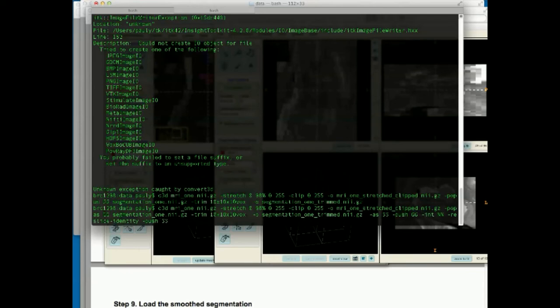Okay, so now here's the final two things. Actually, no, there is OLI. So now there are two images in the stack, the small images. For both of them, we want the slice that we want to display. So the slice command, what it's going to do is slice along the z-axis at a 40% level. You could also specify the actual slice number. So now we got 2D images on the stack, just slices, the appropriate slices.